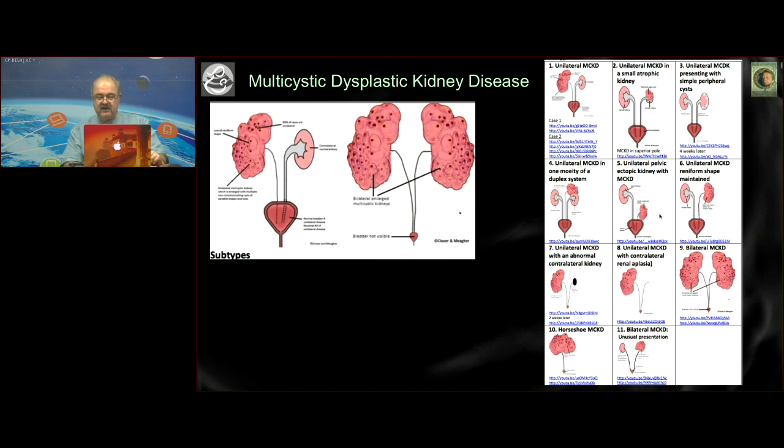He also went on to tell us then that ultimately this kidney can atrophy even in the antenatal phase. So multicystic kidney seen at 18 to 20 weeks might be seen as an absent kidney, truly speaking, later on in pregnancy at 30 weeks or at 36 weeks or at term. Remember that you could even have a multicystic component in a horseshoe kidney as shown in the bottom-most left picture. This chart again is available as a free download on the ISUOG website or on the internet, anywhere as a chart by Simon Ma and his colleagues.